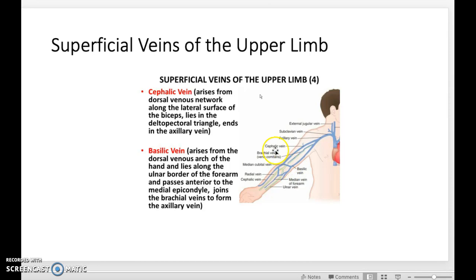And then after that, I call it the 4Ts. You're going to release the tourniquet, apply the Tegaderm. You're going to attach the extension tubing, and then you're going to tape that extension tubing, not under the Tegaderm, over the Tegaderm. So that's your 4Ts: tourniquet, Tegaderm, tubing, and tape after IV access.